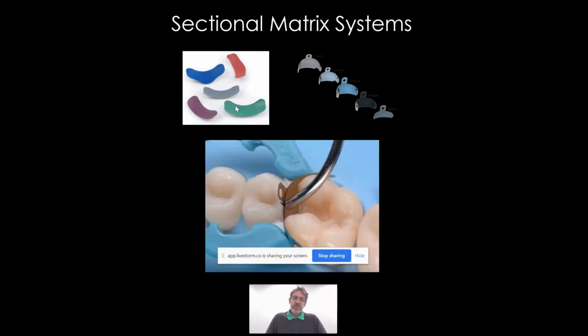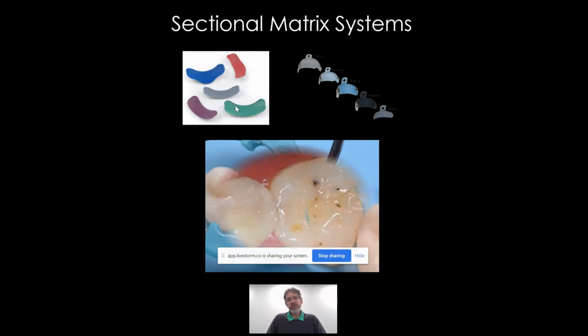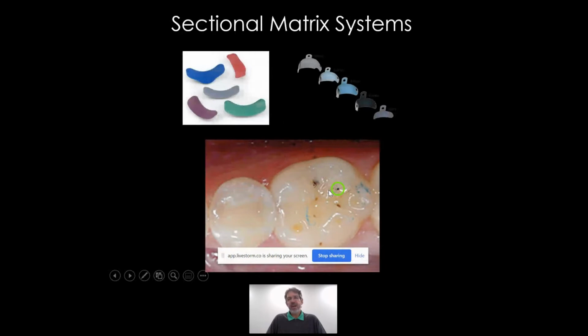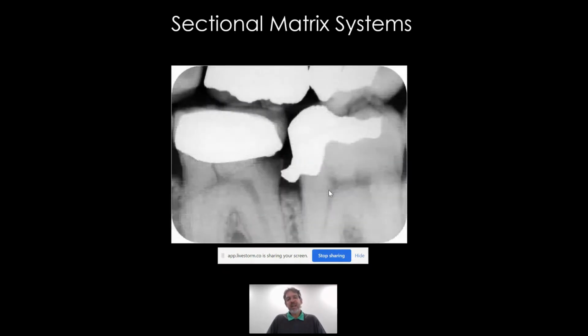And then my question to clinicians has always been, if you are lightly burnishing that band, typically what happened to the Teflon coating? Well, on occasion, as you're busy polishing your restoration, you would see a dark speck, which was part of the Teflon coating that had come off the matrix band, and now you'd have to take something like a quarter round or half round carbide burr, remove that, re-etch, re-apply adhesive, reapply composite, and go through the polishing step to fix that little challenge, if you will. And collectively, all of these challenges lead to overhangs and excess time required to remove excess composite and adhesive flash.